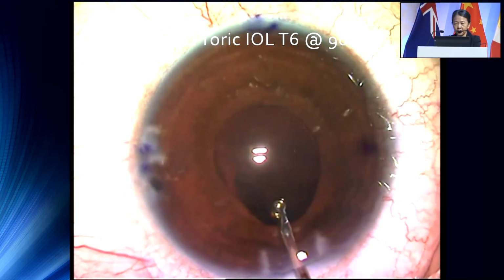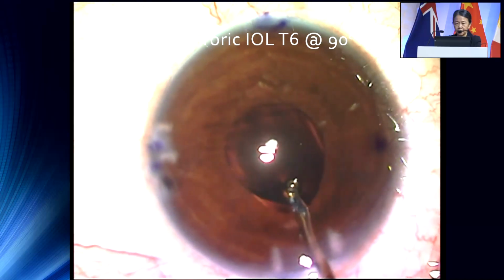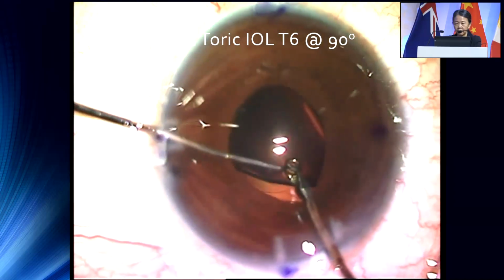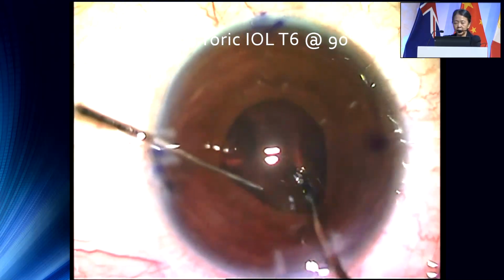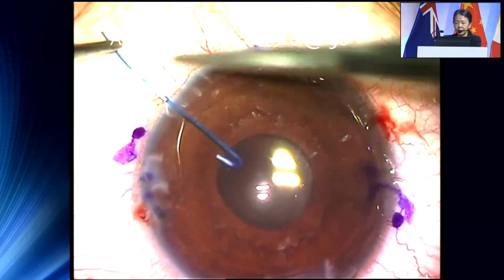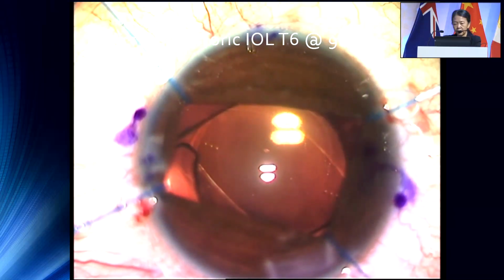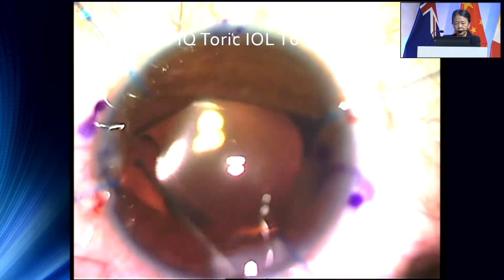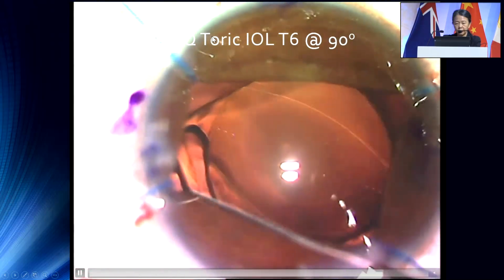So at this stage, I said, okay, it's in a reasonable position. I'm going to do optic capture first. And then after this, I'm just going to check on it, all right? So actually, I should have put in iris hooks first because really I just believed her. And I said, I'm going to capture it here. But I need to be sure that the haptics of this lens are actually in whatever bag is left. So at this time here, I've actually expanded the pupil. And you can see that this part here, the capsule actually has run out. And I'm going to put the haptic in.